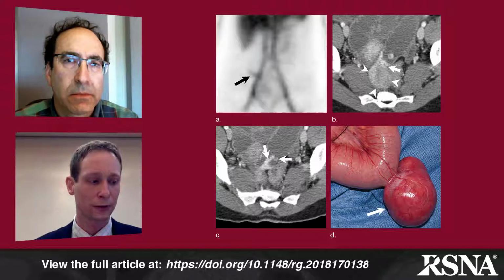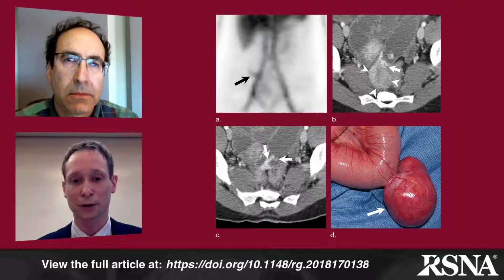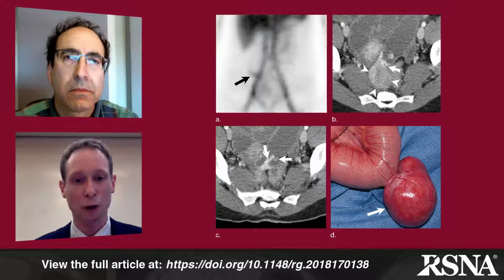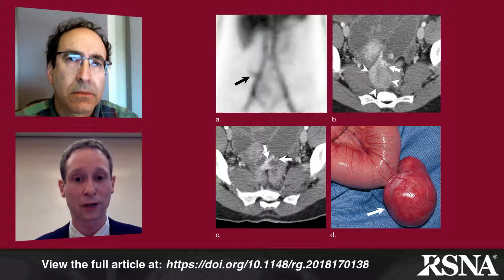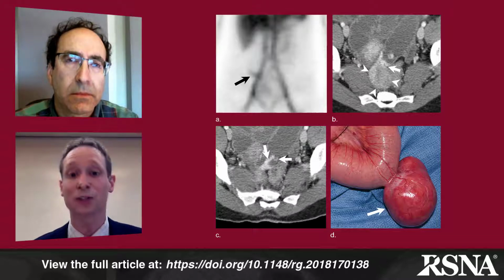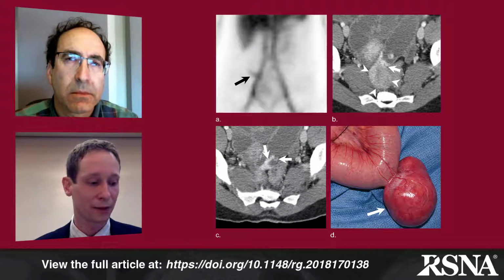On our review of the red blood cell scan, we were more suspicious that this was a small bowel source. In addition, our gastroenterologist got some additional history that her father had a history of small bowel neoplasms removed. Based on those two things, we were highly suspicious that she also had small bowel pathology. The decision was made to go ahead and perform a multi-phase CT enterography to optimize our evaluation of the small bowel.